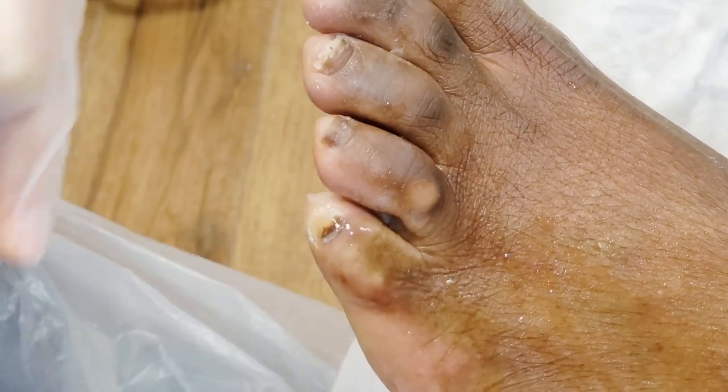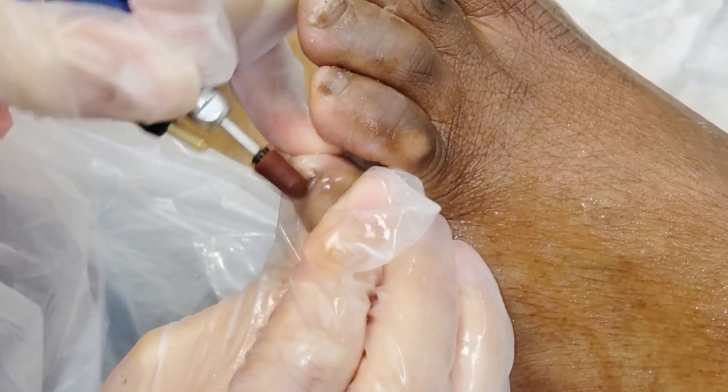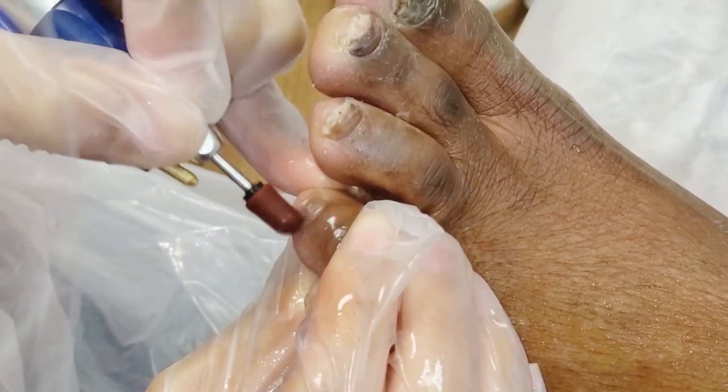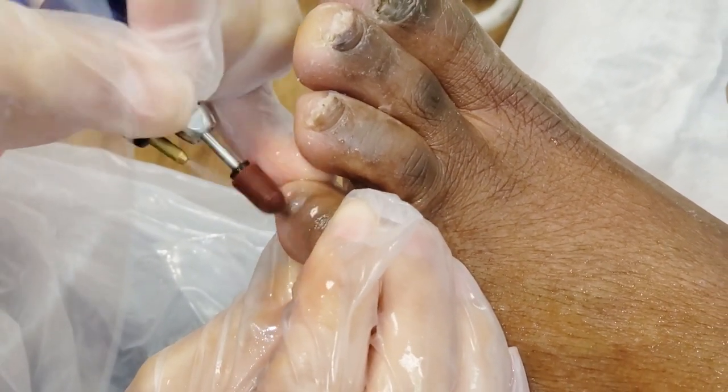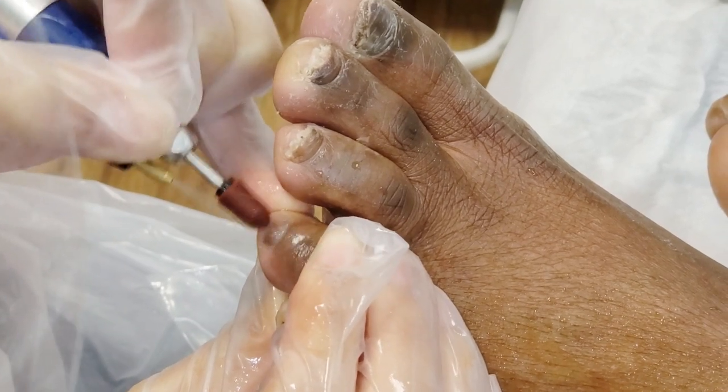Sometimes when you have fungal nail infection, it's just too powerful and none of the treatment works. So what we find is the debridement helps and increases the chance of the clearing. This is what we call the debridement of the nail.